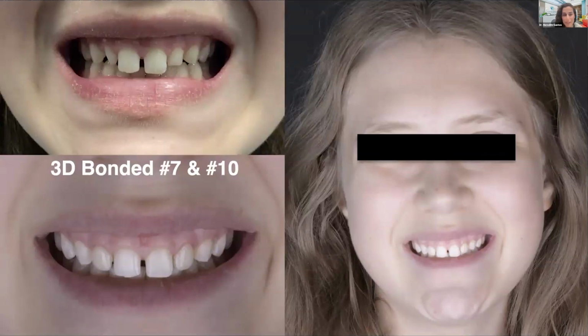I wish I'd thrown it in this presentation, but the most hilarious thing I've ever done to another human being was a full maxillary arch of 3D printed temps and, bless her heart, she ate turmeric. And what turmeric does, of course, to bisacryl and to printed resin, but she came back in and she looked fit for Halloween. So we do have to be mindful of some of those things, but for a situation like this, it works really, really well.